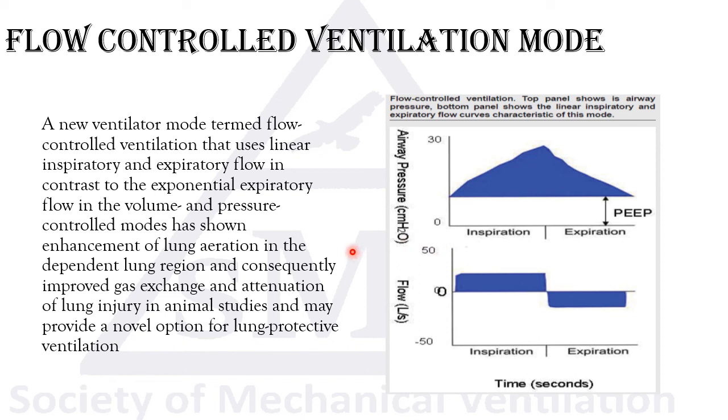in both inspiration and exhalation, and only a few studies talk about it, showing some enhancement of lung aeration in the dependent lung regions with some improved gas exchange and decreased lung injury in animal studies. The authors of those studies claim that it might provide a novel option for lung protective ventilation. Again, there are not many studies about this new mode, but I just wanted to put it there.